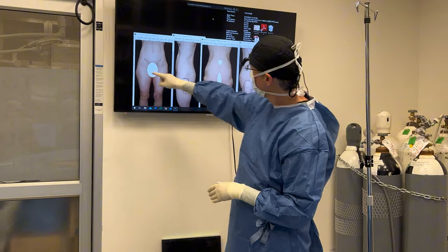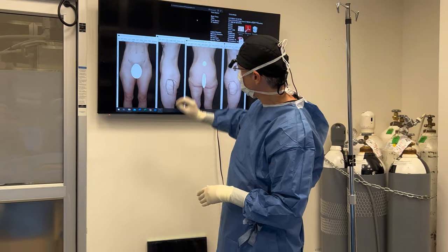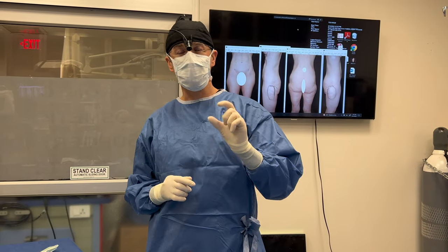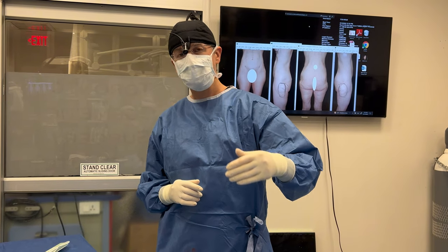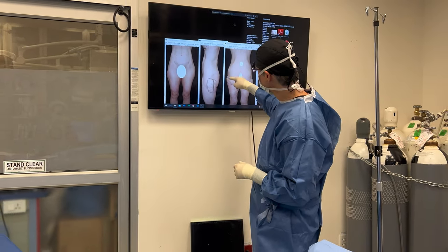Her right is a little bit lower than her left. So I'm going to go ahead and do just a very, very gentle lipo, a very small amount. The problem here is not so much fat as it is skin laxity — her fat and skin is kind of falling out. So in addition to the liposuction, we'll do the Renuvion. We'll do lipo plus and try to tighten up the skin just a little bit, because that's the real problem here: skin laxity.